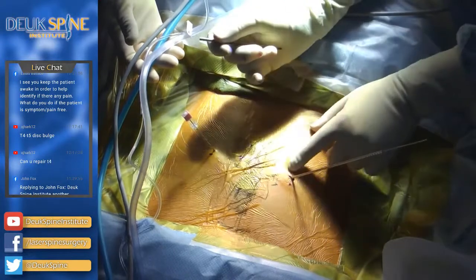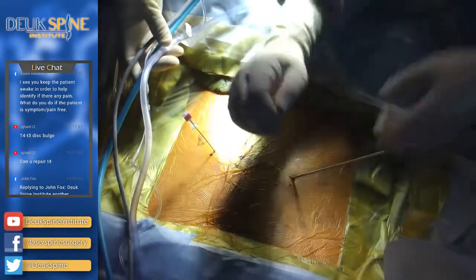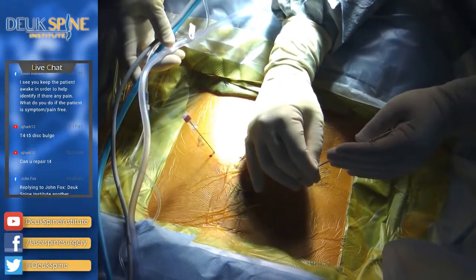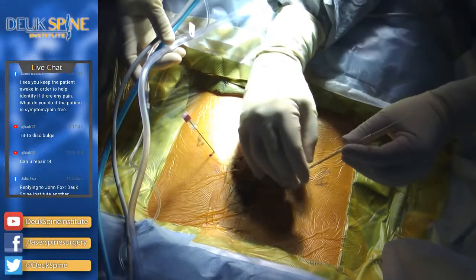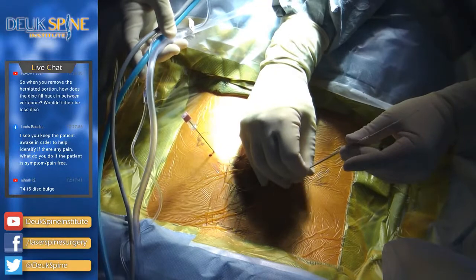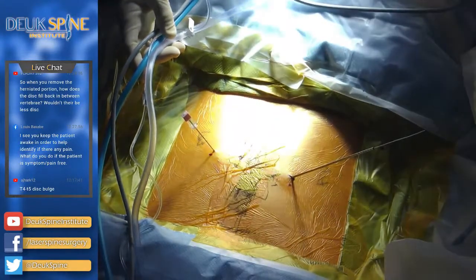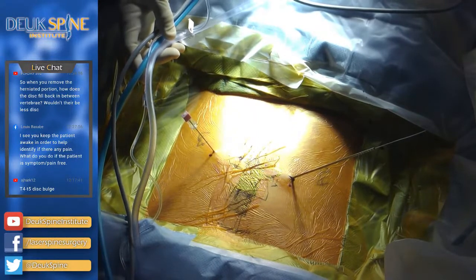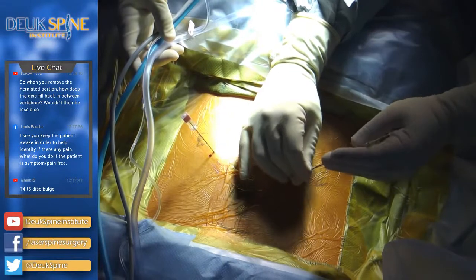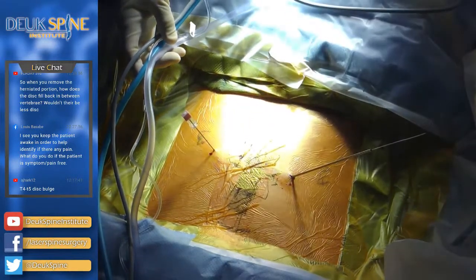So it's a real surgery with a real incision, and it's going to save this patient's life, I'm hoping, because had he gone for the hospital surgery with a huge incision, like I told you, it's a 1 in 5 chance of serious complication, even death. Okay? I'm going to bring my dilator down. I'm up against the fascia right now. I can feel it. I want to make sure I don't pinch the guide wire and drag it forward into the thoracic cavity, which would be bad form, shot.